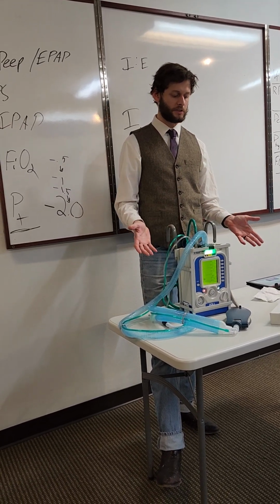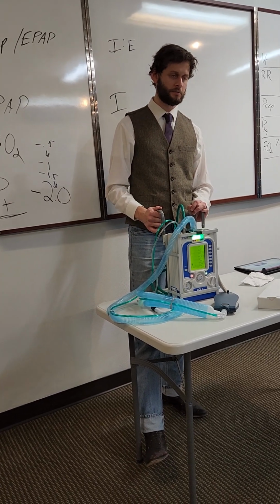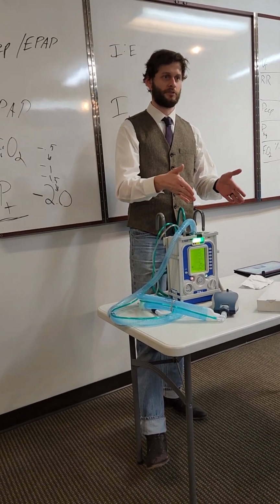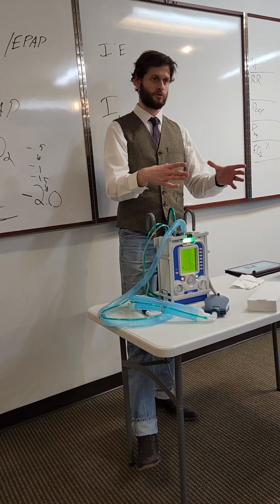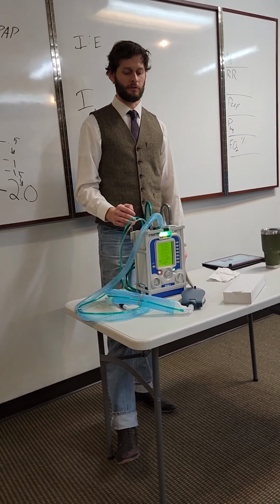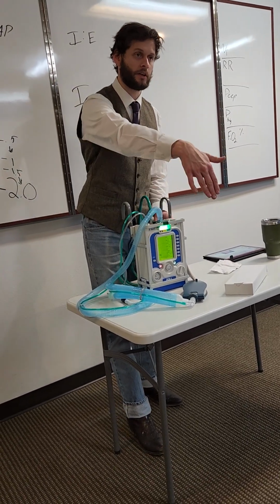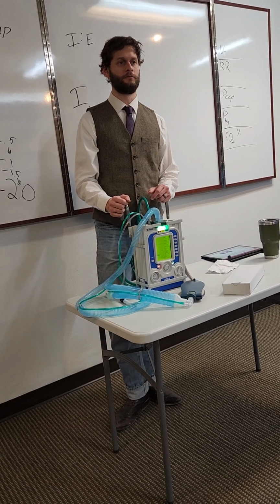It's a smaller package. Works a little better. I found that the best place to put it is the back of the stretcher, that little tray area. Stick it right on there. That's the easiest way. I suppose you could have it hanging off to the side because it doesn't stick out like the Newport one if it hangs off the side either.